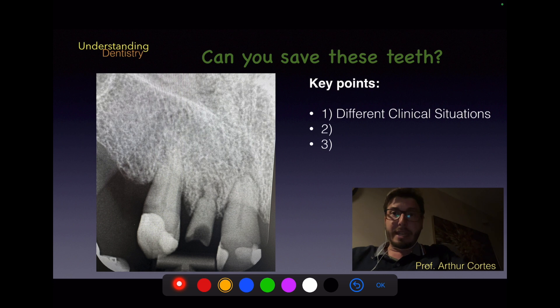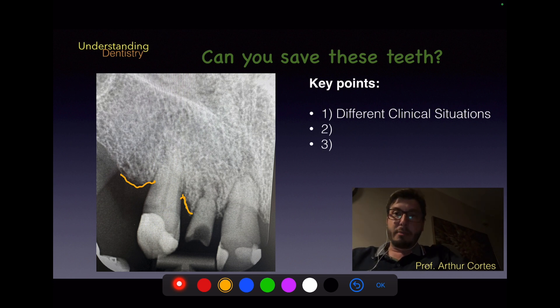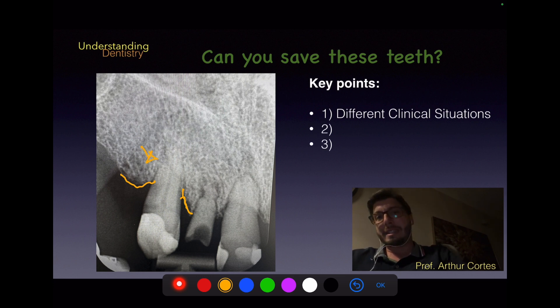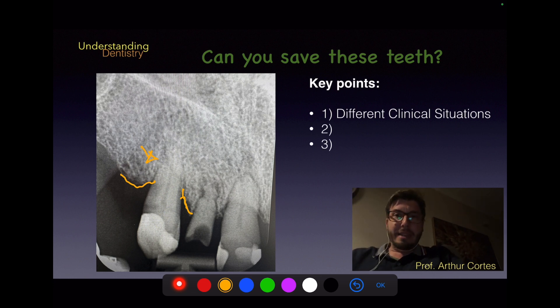Now for the canine: the bone level on the distal aspect shows marginal bone loss at the middle third of the root. On the mesial aspect there is a vertical bone defect. There is also periodontal ligament space widening, suggestive of periapical PDL widening, and possibly some external root resorption — though the radiograph quality limits interpretation.